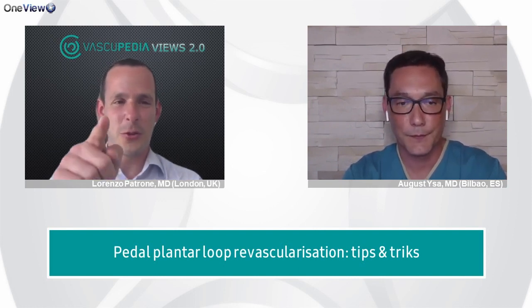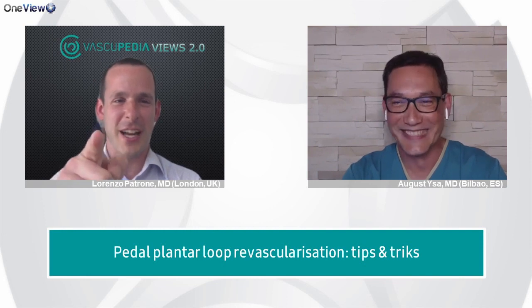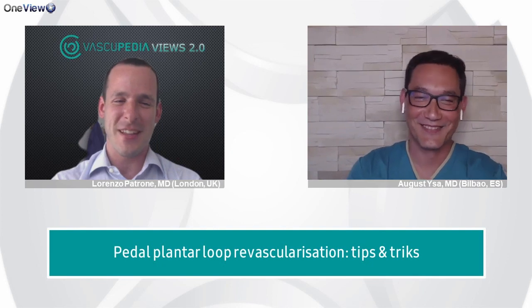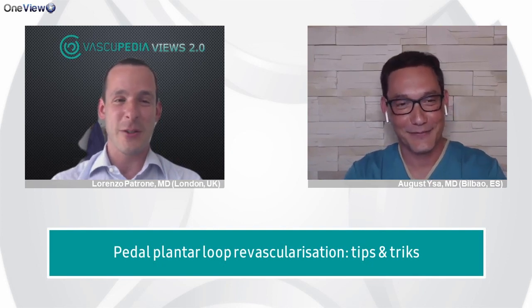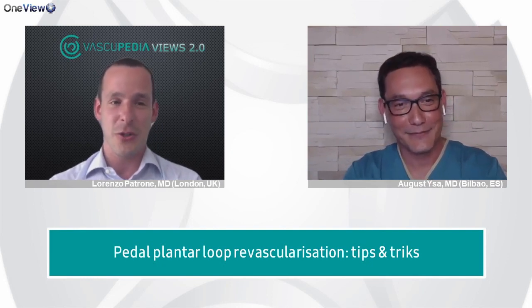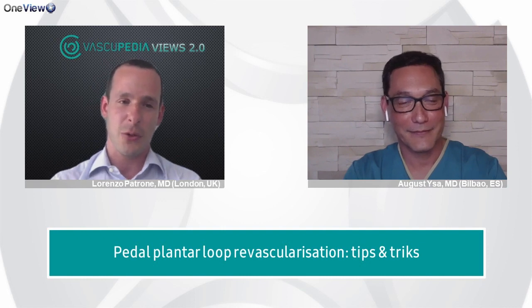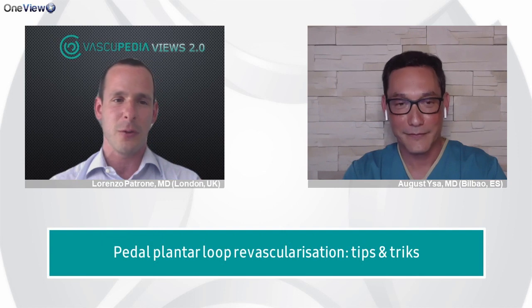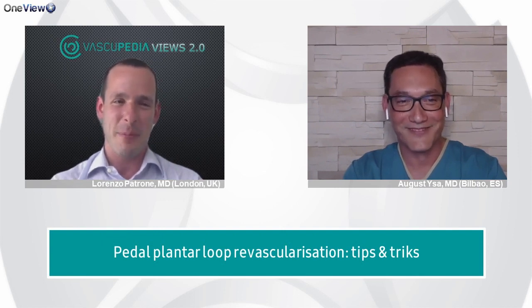Great. So now you, young guys who are following us, remember that you need to do the anteroposterior view of the foot always. And it's also very nice that you presented the recanalization with the two projections, so you move, you move, you move. You are very dynamic. You have to be a patient radiographer, but this is the only way not to end up in a potential disaster.